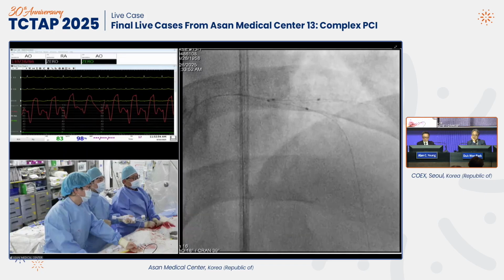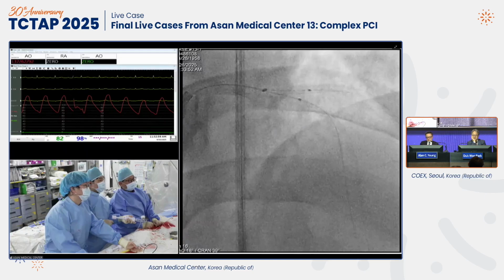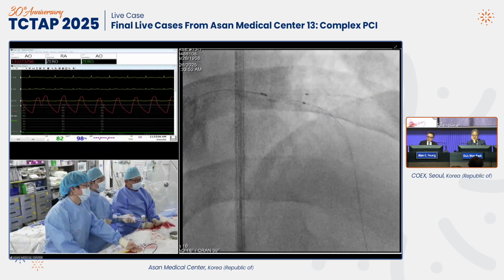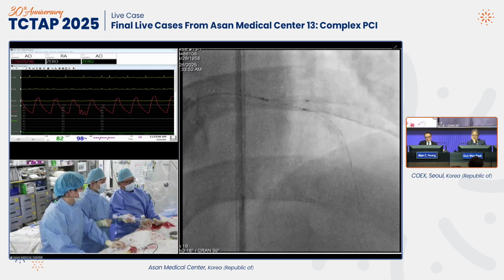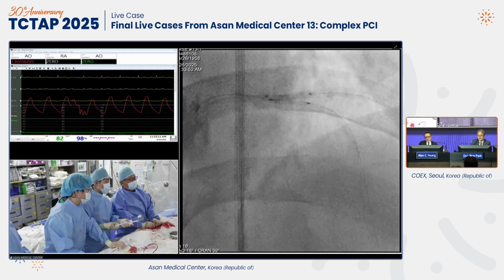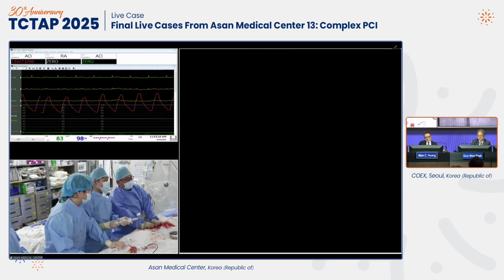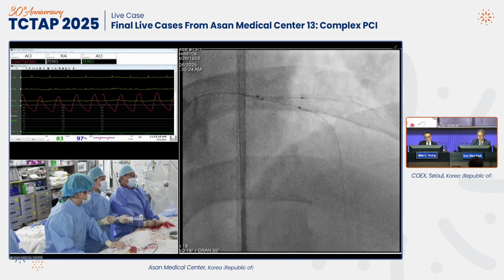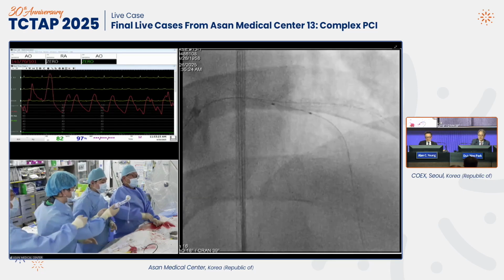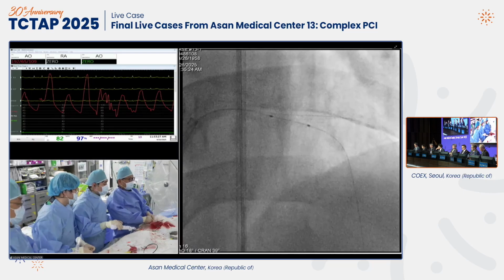So after side branch stent implantation, somebody called it the side branch optimization, similar to the POT. This is the side branch optimization technique. This is a 2.5 high pressure balloon, increased more to oppose the side branch ostium, fully expanded, 18, 20, deflation. I think this is a very important technique. Yes, this facilitates rewire and balloon delivery.